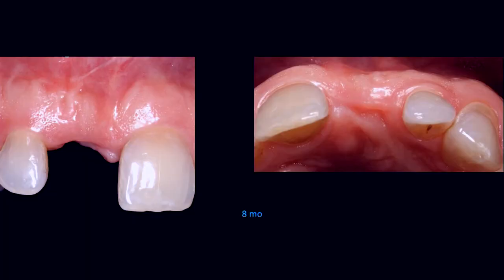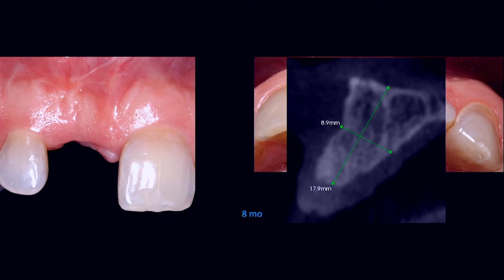So here's this patient now at 8 months. All you need is 5 months. With his schedule in mind, we didn't coordinate, but we waited 8 months — and by 8 months you've got D1 bone. With Mineross and PDGF, it's D1. It's not even D2. It's beautiful bone.